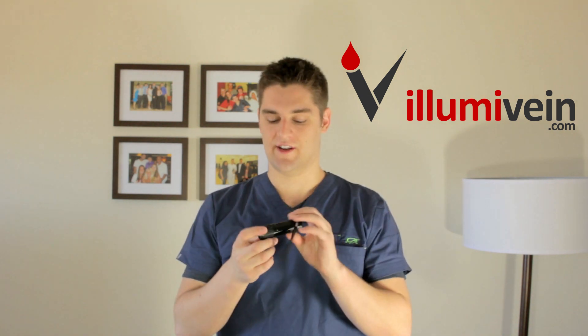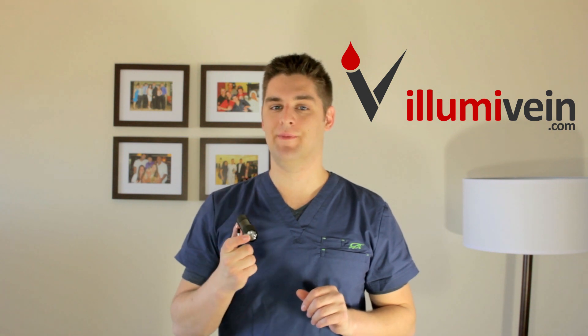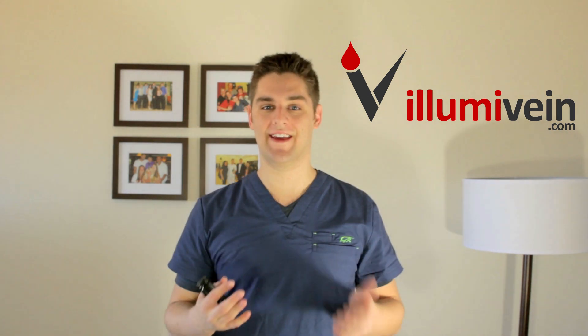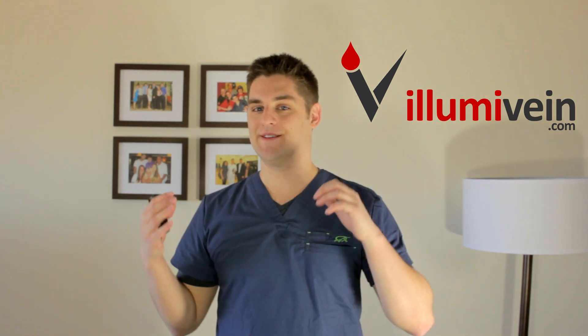Hey guys, I just got my hands on the all new Illumivein Transilluminating Super Bright Red High Power LED Flashlight. This thing is a must-have if you're ever dealing with people where you just can't find their veins — those veins that are really deep, you can't see them, you can't palpate them, and you have to get an important IV or blood draw.